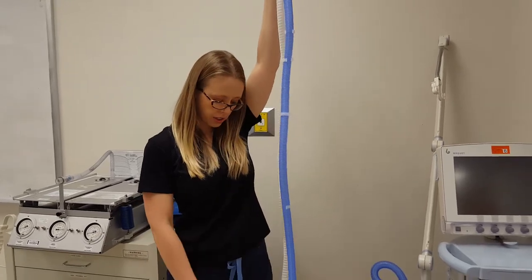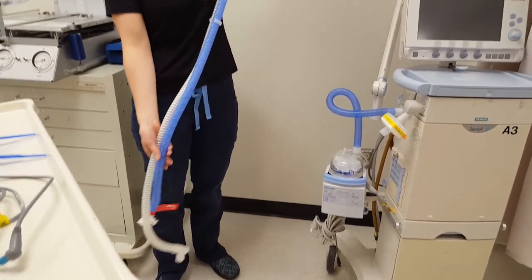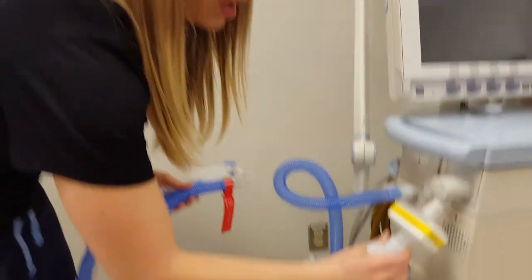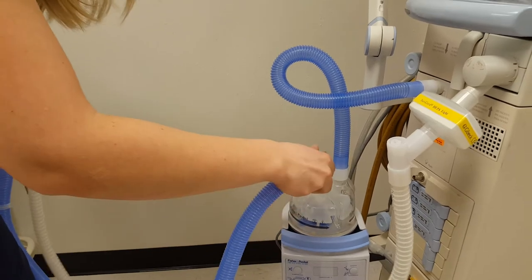Make sure the circuit never touches the ground or anything dirty, as it's going on to your patient — keep it as clean as possible. Your white expiratory limb will connect to your HEPA filter, and the blue inspiratory limb will connect to the wet side of your heater.